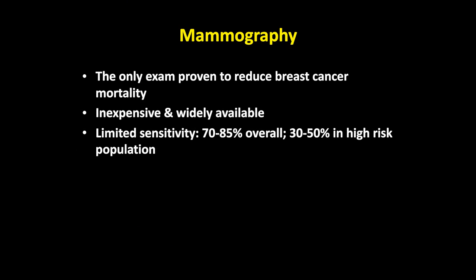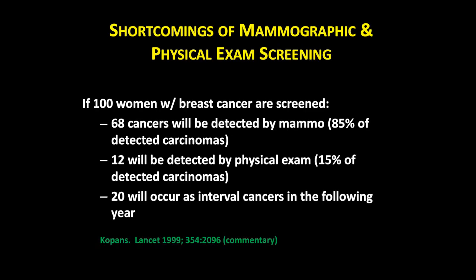Mammography is the only imaging examination that has been demonstrated to reduce breast cancer mortality at this point. It is inexpensive, widely available, but the sensitivity is not perfect. 70 to 85% in the overall population, but this drops significantly in women with dense breasts and increased risk.